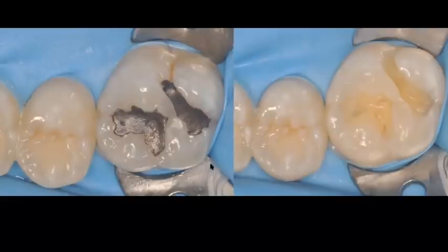And normally where they sit is in this central fossa. So make sure that you understand the concept behind this technique, so that we know why we recommend using it.